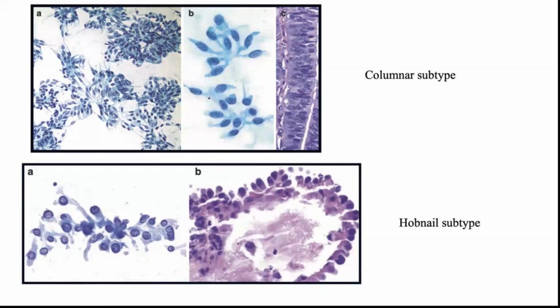They consist of columnar cells with hyperchromatic nuclei, oval and pseudostratified nuclei, which reminisce of any secretory epithelium like respiratory epithelium. They have supranuclear or subnuclear cytoplasmic vacuoles. They may have papillary, trabecular or follicular pattern cells. However, the nuclear features of classic PTC are less prominent in columnar subtype.